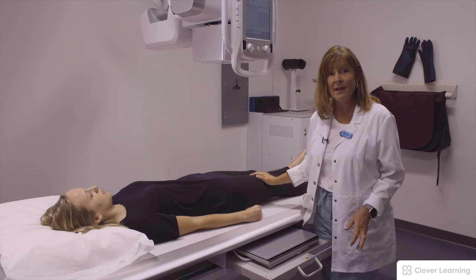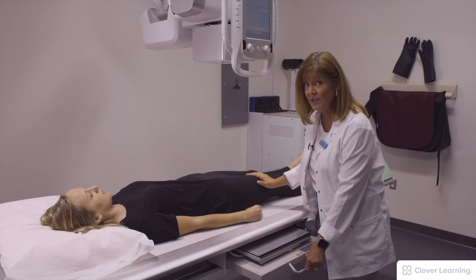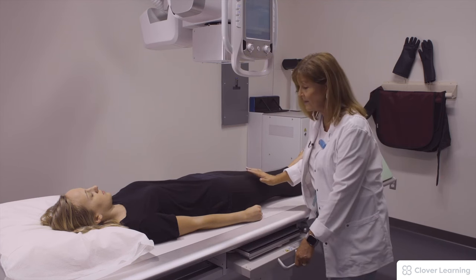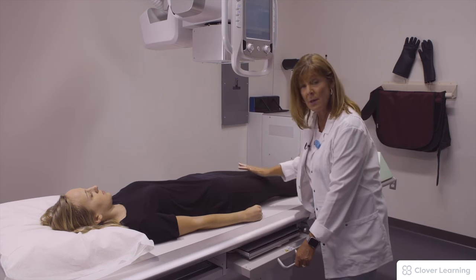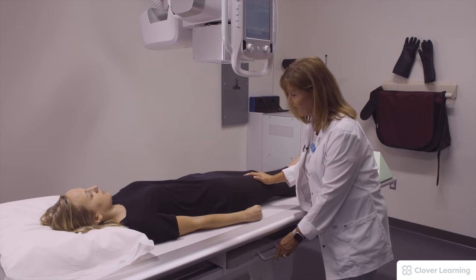I have my patient supine on the table. I am choosing not to shield for this because it would obscure diagnostic information.